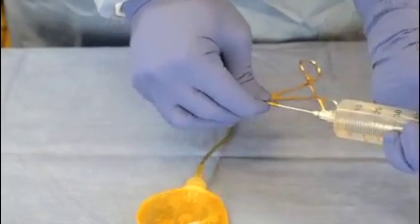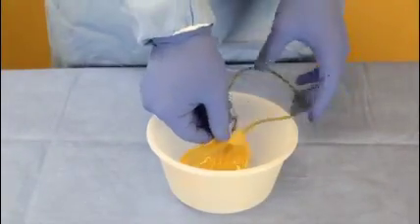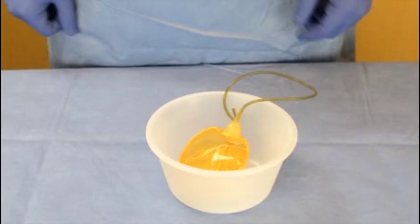For components treated with InhibiZone antibiotic surface treatment, place the prepared reservoir onto an empty, non-covered sterile tray, empty kidney basin, or sterile Mayo stand. Components should not be submerged in saline. Soaking antibiotic-impregnated devices in saline will cause the antibiotics to diffuse off the device into the solution. This will cause the solution to turn orange.